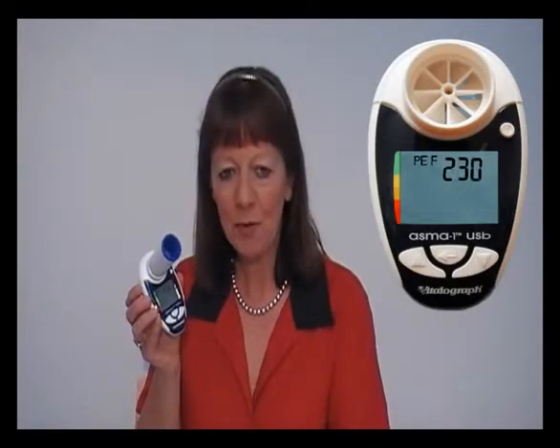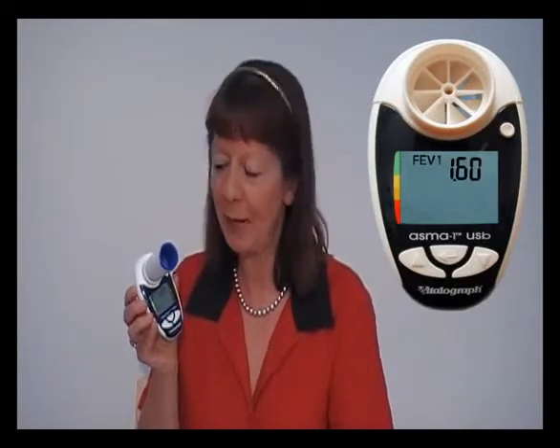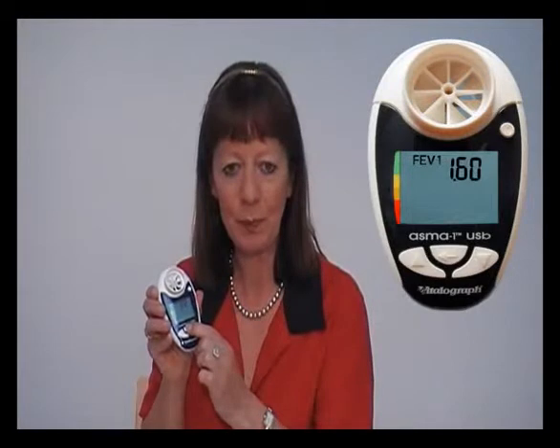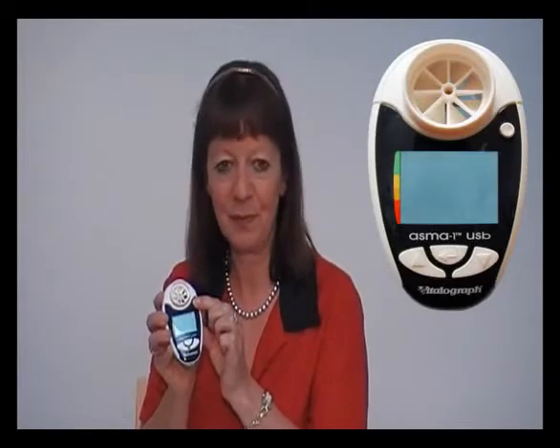The peak flow and FEV1 measurements will be displayed alternately on the screen. Press the middle enter button to display the best blow. Use the circular button to turn off the device. The AsthmaOne will automatically store the best values from the session and will store up to 600 test sessions.